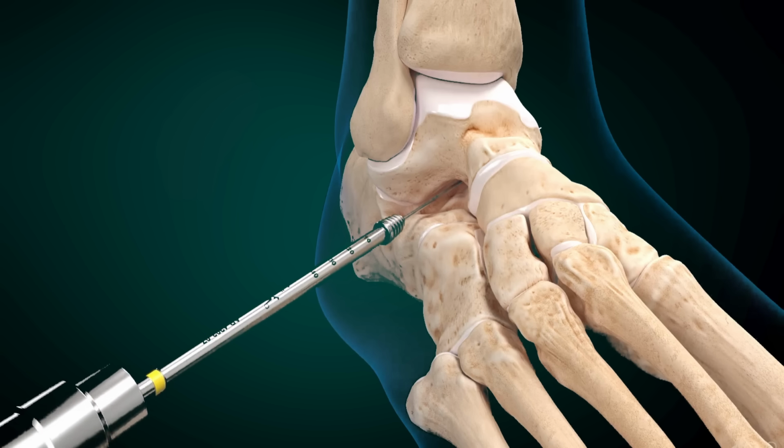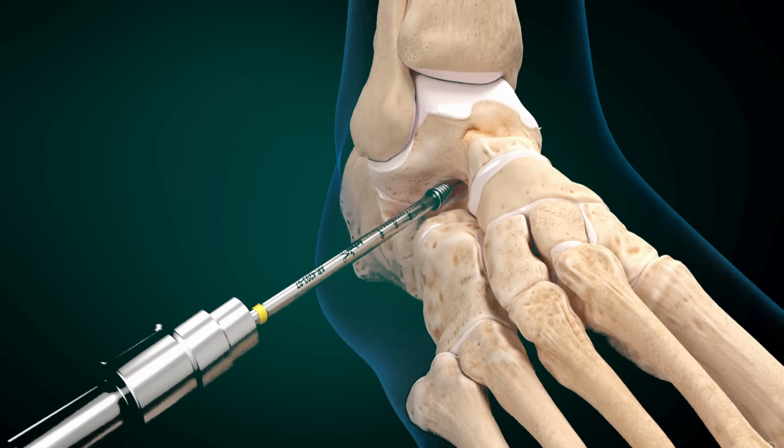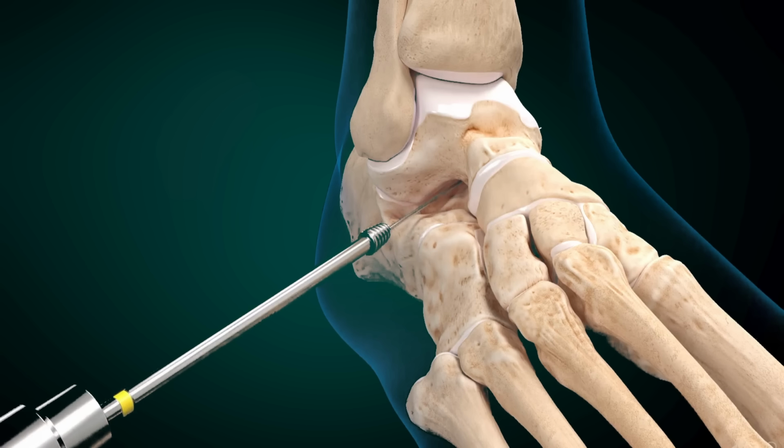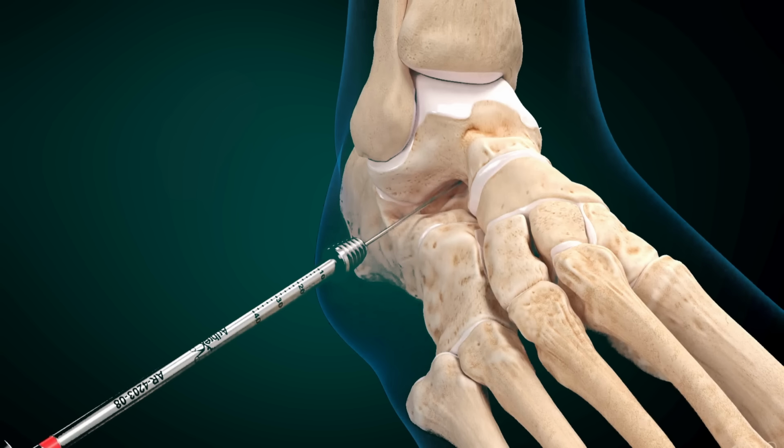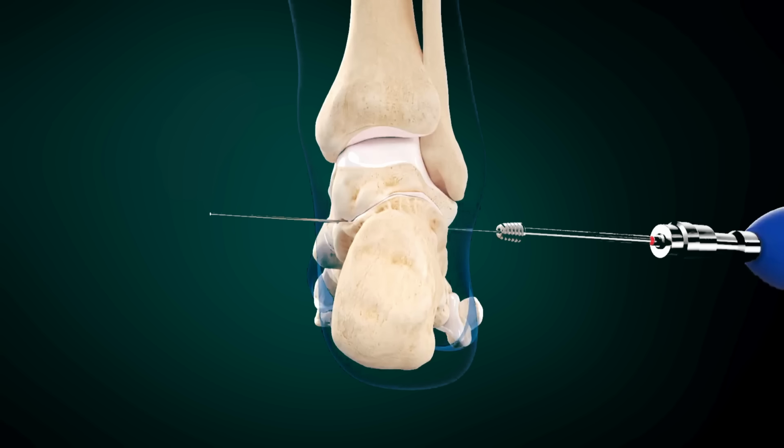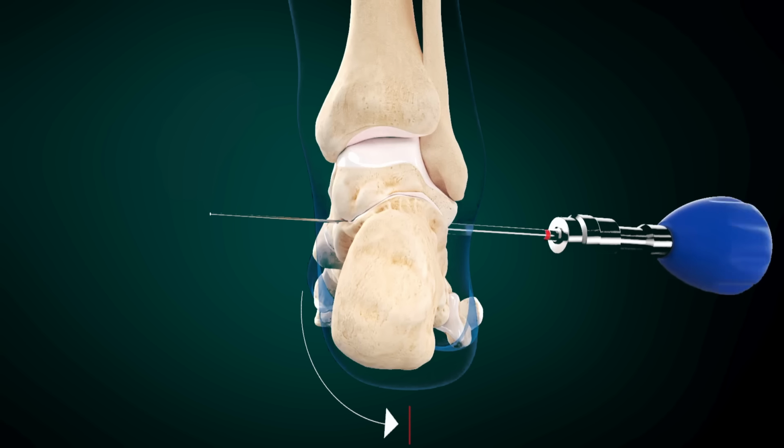The shafts of the trial sizers are marked with a laser-marked scale to measure the depth of the sizer. For most patients, the correct placement can be assumed when the 20 mm laser mark reaches the skin. It is mandatory to screw the trial sizer in and out and not to pull it out. This is to prevent injury of soft tissue, such as the interosseous ligament, which plays a major part in holding the final implant in place.